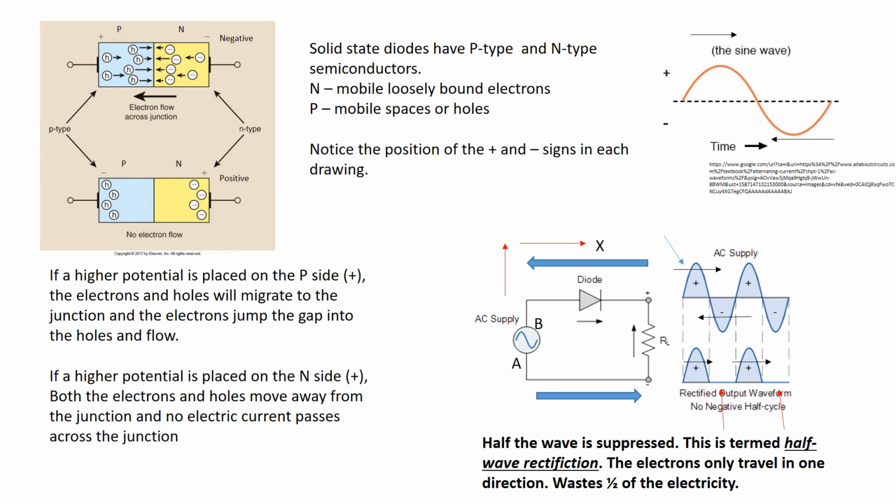That bottom hump underneath the horizontal line is gone again. So what we're doing when we have this configuration is we are creating something called half-wave rectification. Basically, what have we done? We've allowed half of the wave to go, and the other half is gone.